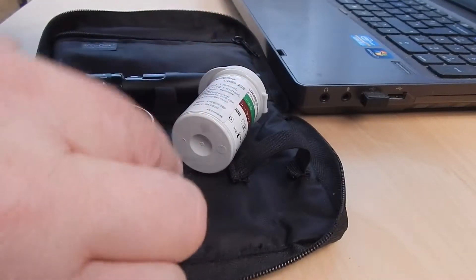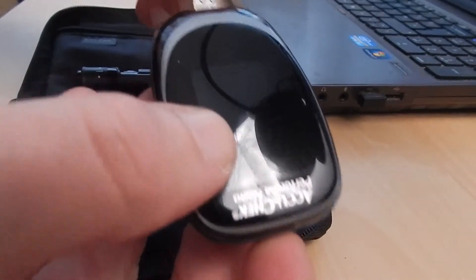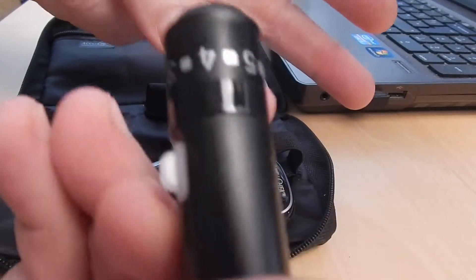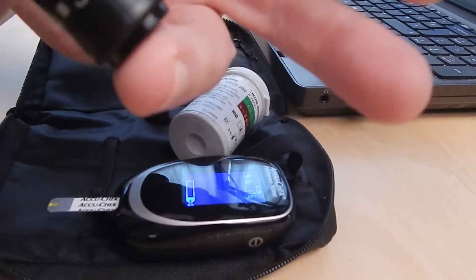These are the testing strips. There's a chip at one end that you feed into the meter, and then there's the measuring dipper — I guess the dipstick — at the other end. 222: that's what comes up — I don't know what it means, but every time I put a new strip in, it pops up 222.